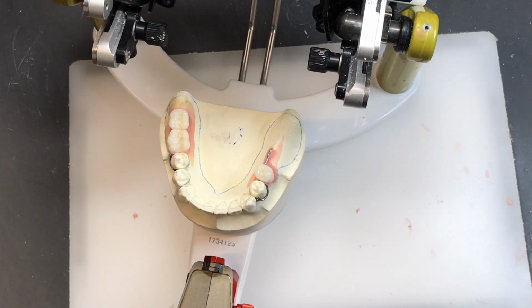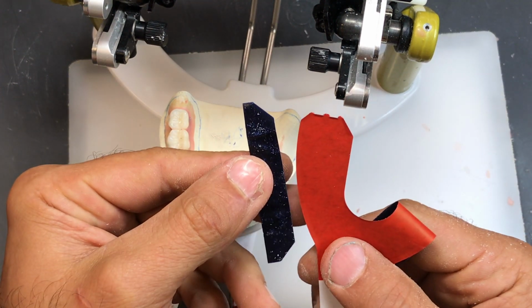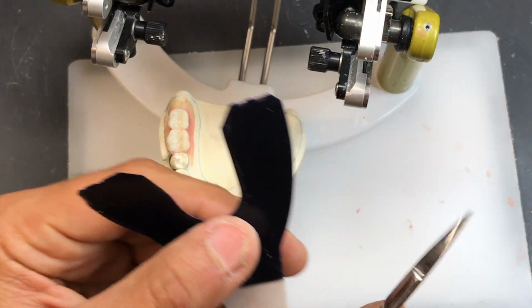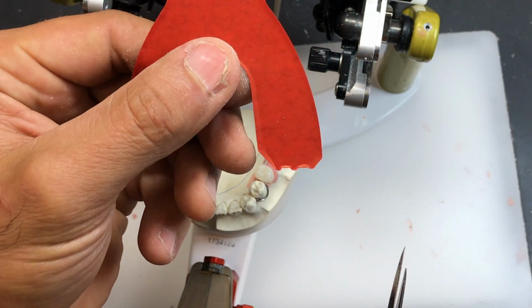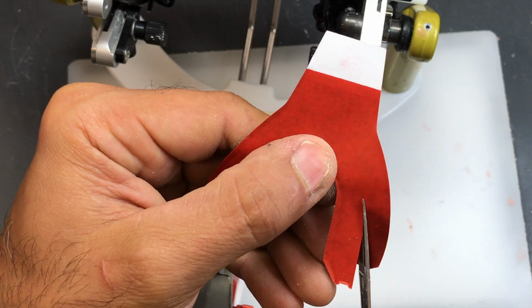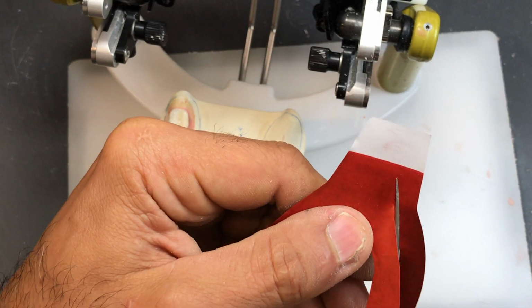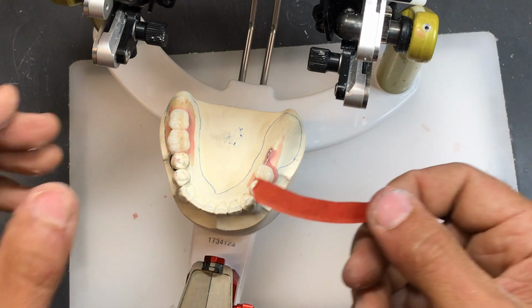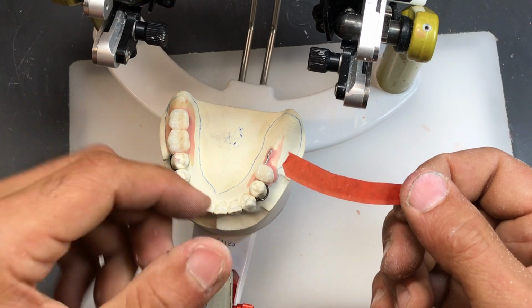And I'm going to take some articulating paper. So basically what I did, I took some articulating paper and I cut it down in half. I don't like working with thick strips like this. This is way too thick. So you can take a paper like this or take the back side, which is straight, and cut just a thin strip so you can check each tooth individually without making a whole lot of mess with the articulating paper.